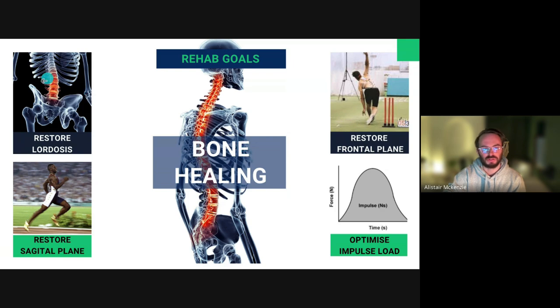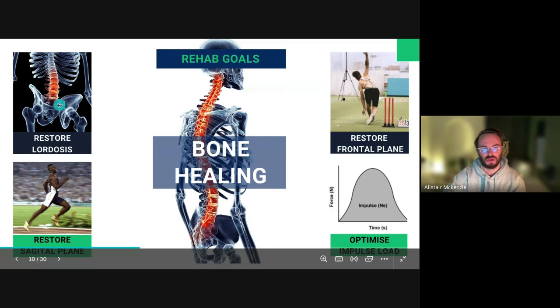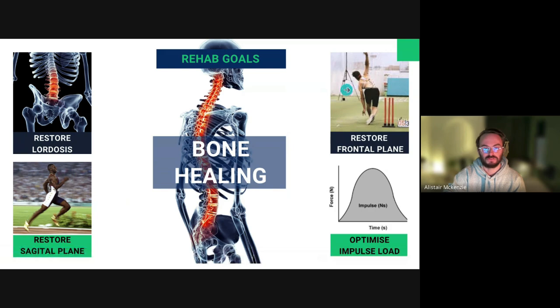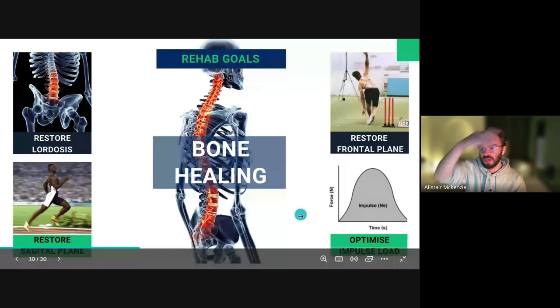So we have to be able to control left and right. And again, in an extended posture with a good lordotic spine, when you apply a lateral flexion to the trunk, you'll get a subsequent tertiary axial rotation due to the geometry of the spine, which is one of the most efficient ways of producing locomotion from vertical to an axial or horizontal gait. And then obviously in cricket, we're going to look at restoring extreme control of lateral flexion, but that would be in the later stages.